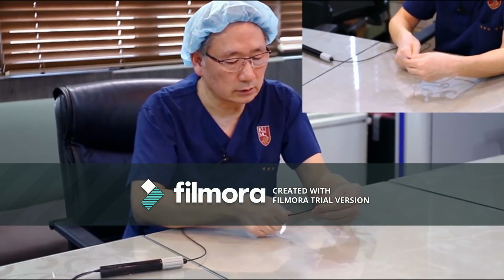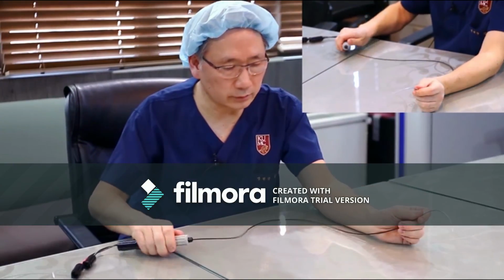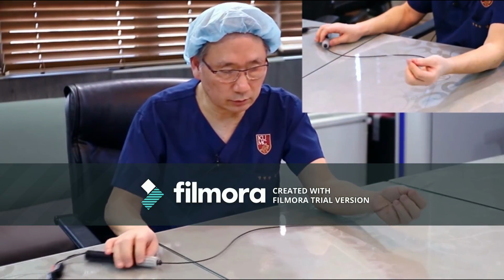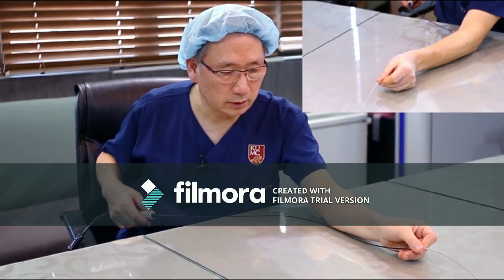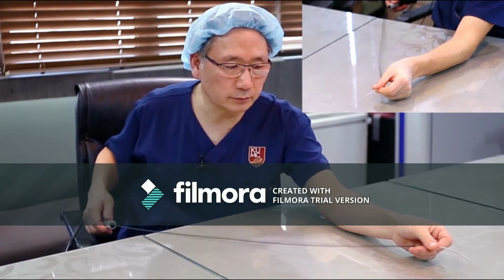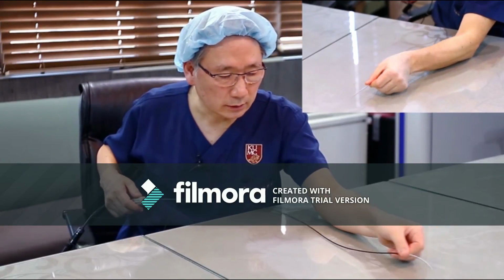I use the Duodeca, which is hollow, for the coronary sinus engaged from the femoral vein. Once I confirm it should be free without any curve first, when I touch the RA first on the AP view, then I insert a little bit more.